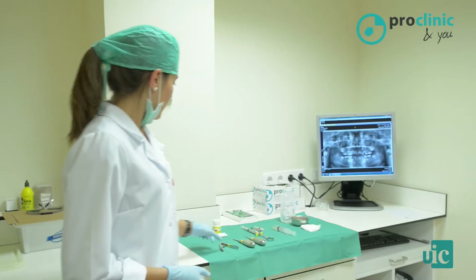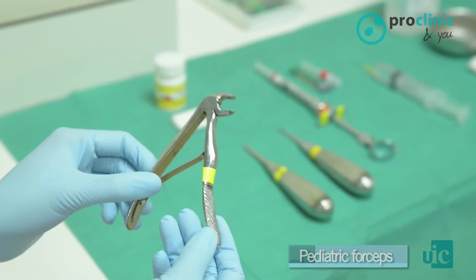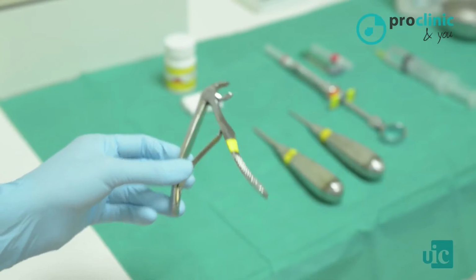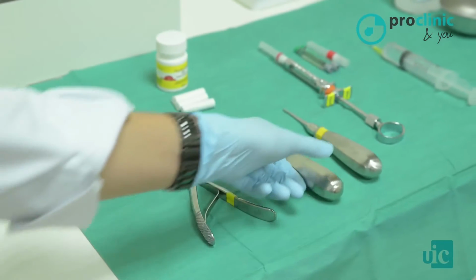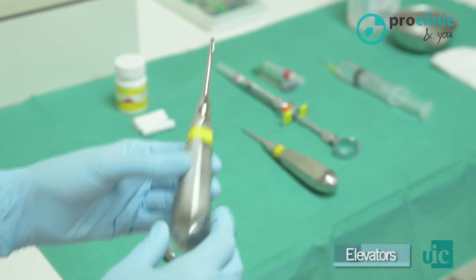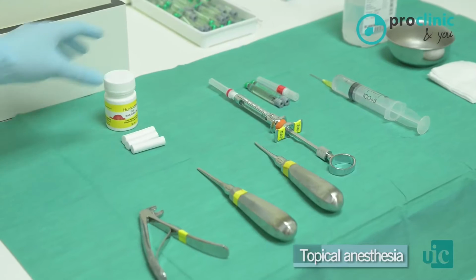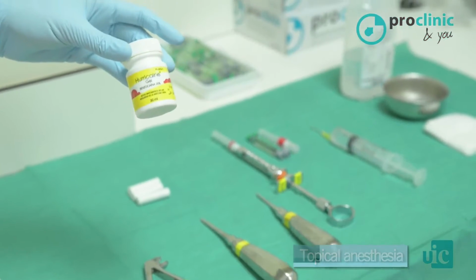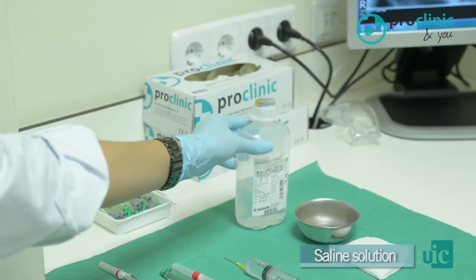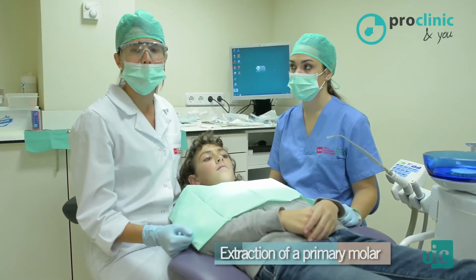However, we use smaller forceps because children's oral cavity is smaller. In this particular case, we have molar forceps, but we also have one for canines and another one for incisors. The elevators are the same as in adults. Topical anesthesia, which is commonly used in pediatric dentistry, allows us to decrease the discomfort of local anesthesia. We also use local anesthesia and a saline solution to clean the socket. We are performing an extraction of a second primary molar.